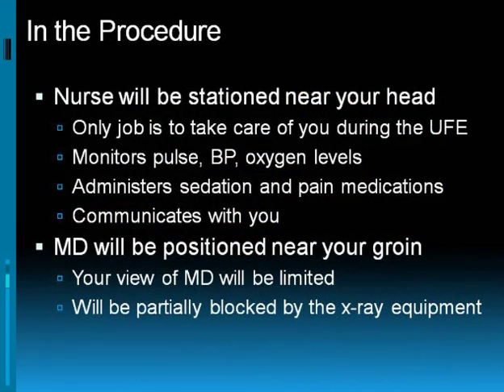Now, during the procedure itself, there will be a nurse stationed at the head of the table, and the sole job of that nurse will be to take care of you during the UFE. That nurse is not participating in the procedure itself. They're simply there to monitor you. They'll be watching your pulse, blood pressure, and oxygen levels. They'll also be administering the medications that we use both to sedate you and to control pain.